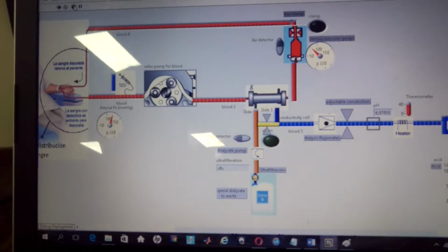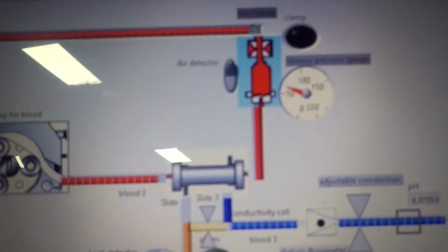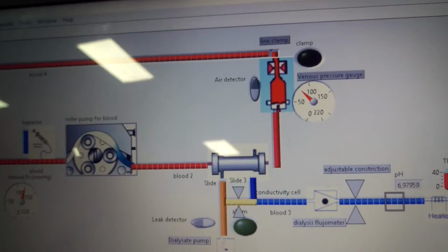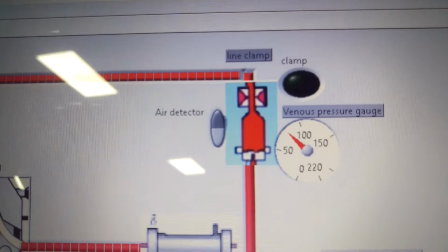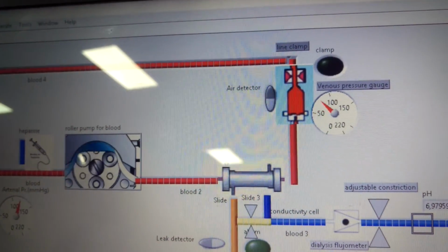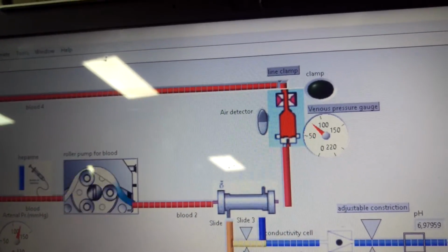A venous pressure which is monitored and indicates the pressure entering the patient and if it is entering in optimal conditions. On the other hand, we find a clamp on the venous line, to avoid that by gravity blood goes down in a pause to the patient. There are also clamps activated when an air bubble is present so it does not return to the patient.